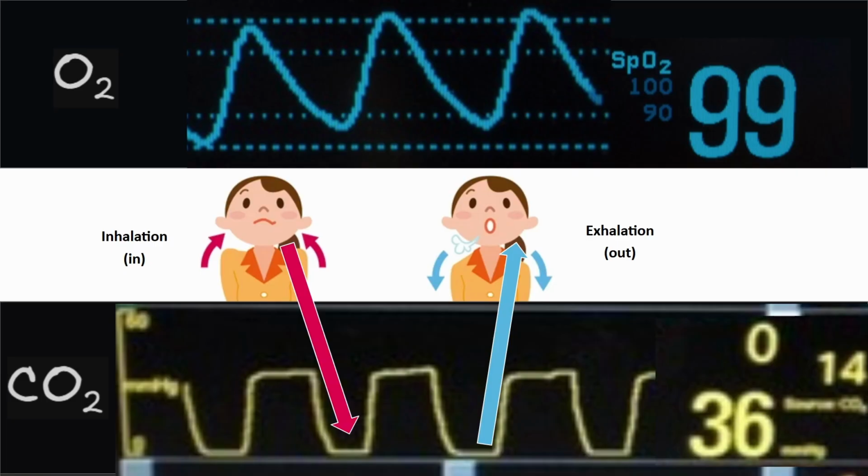It should also be noted, I don't have a slide on here, but these waves are measured chronologically from left to right, and it's always a bit arbitrary. I mean, we can't see this number. Well, I guess we can see over there, that's 36. So we can tell because of the capnometry that this is an appropriate amplitude, meaning up and down, right? 36 is healthy, we're okay with that. And I suppose we could technically tell the rest, that's probably the respiratory rate, which is 14.